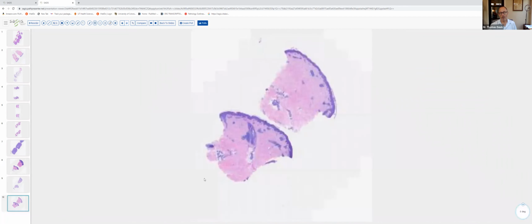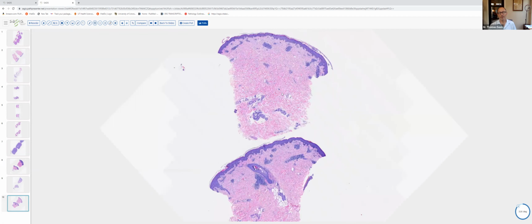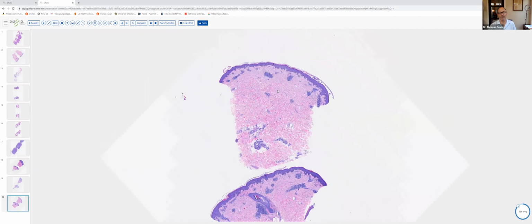And finally, our last slide. This can be a great mimic. This is a condition which can produce so many findings, and it's kind of like syphilis clinically. In this particular punch biopsy specimen from the trunk, one can see an inflammatory infiltrate centered in part around vessels of the superficial and deep plexus.